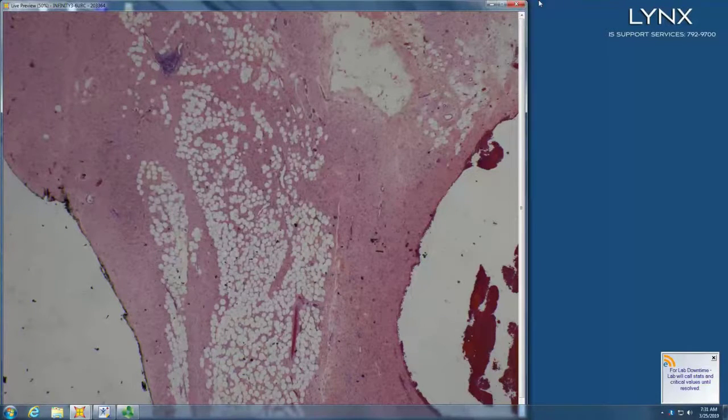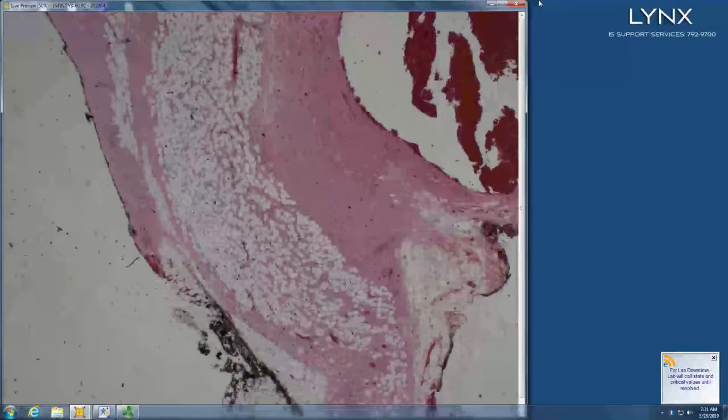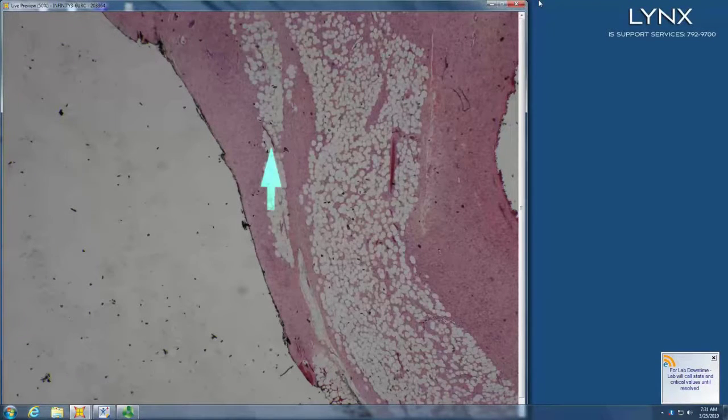In diffuse neurofibroma, you have very prominent CD34 staining in a thumbprint pattern. So it's a very characteristic pattern that you get in neurofibroma. What about spindle cell lipoma? Spindle cell lipoma would be a thought. You usually don't get single file rows of lipocytes in spindle cell lipoma. And you usually don't get big, long, parallel fascicles of fibrous tissue.